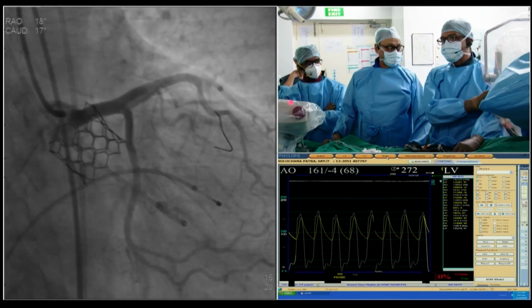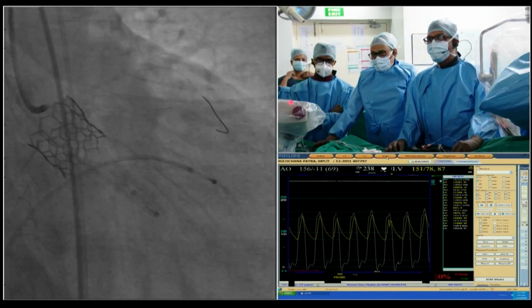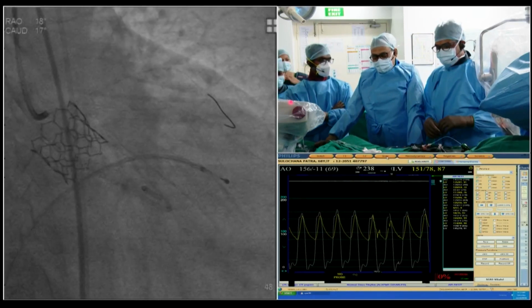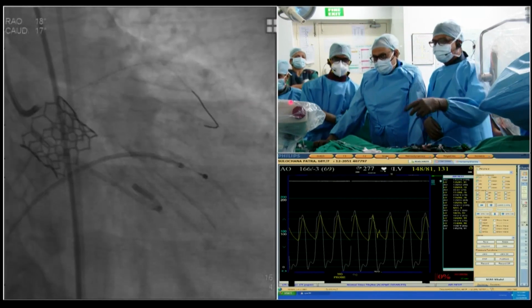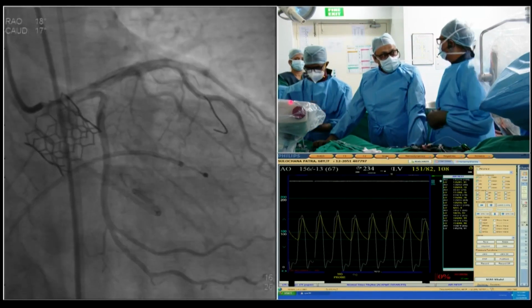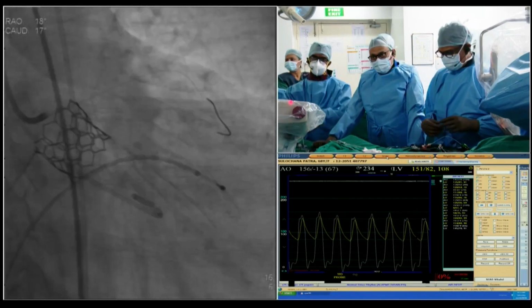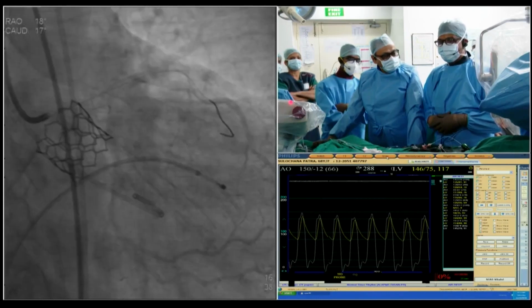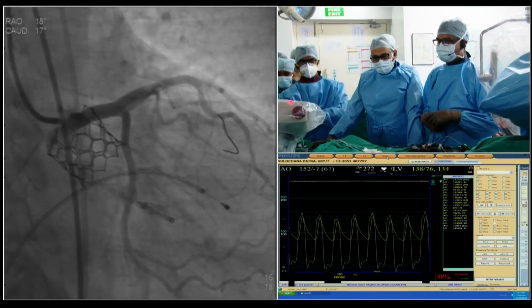Perfect, he says, and perfect. So anybody else in the house who would like to do something? Because I think we are all quite comfortable. Anil, he wants to show the EKG. Can you bring the... Anil, do you think there is a role of IVUS there? We'll put it to debate. Not in our minds, but if there is anybody here who would like to ask for an IVUS, please say your bit. Amit is walking up to the mic.